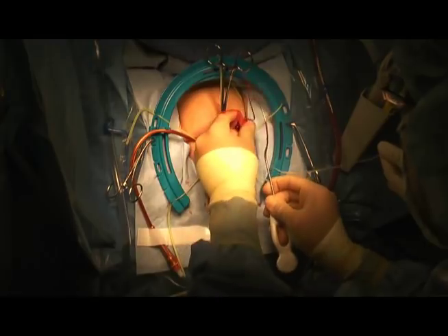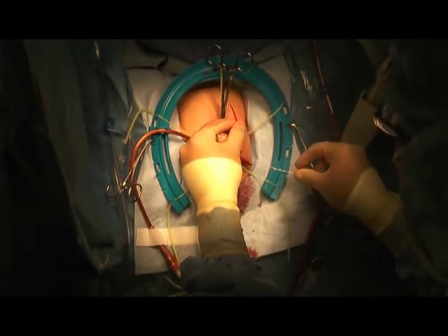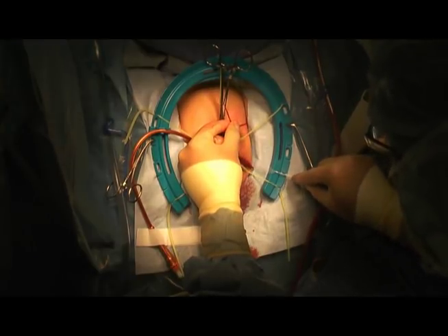Here you can see it being pulled out. Then I'll go ahead and secure the mesh so it doesn't get wet — you see me here placing it right on the retractor.